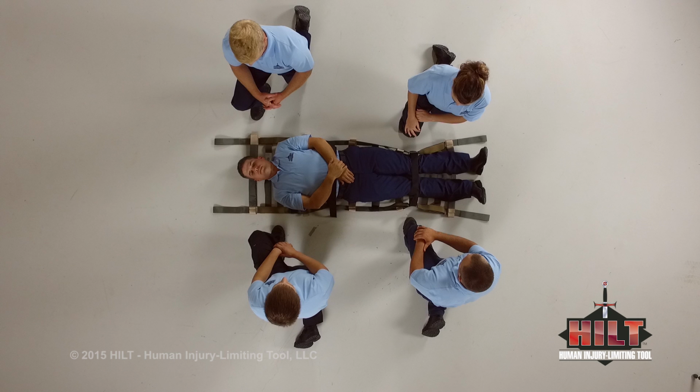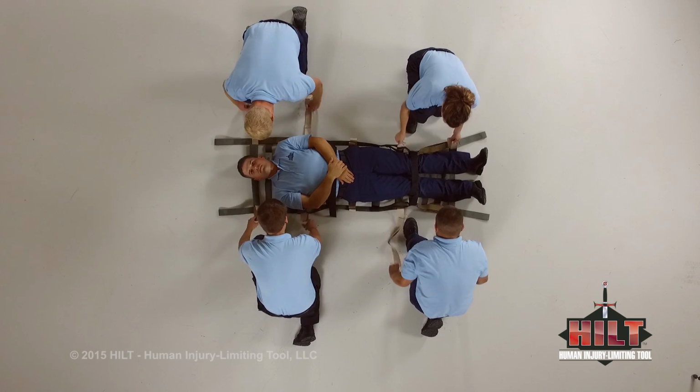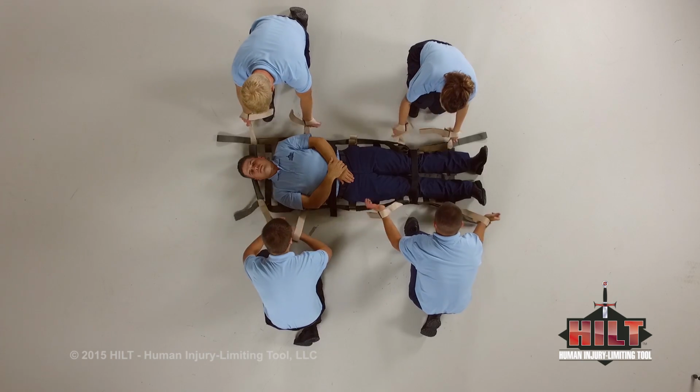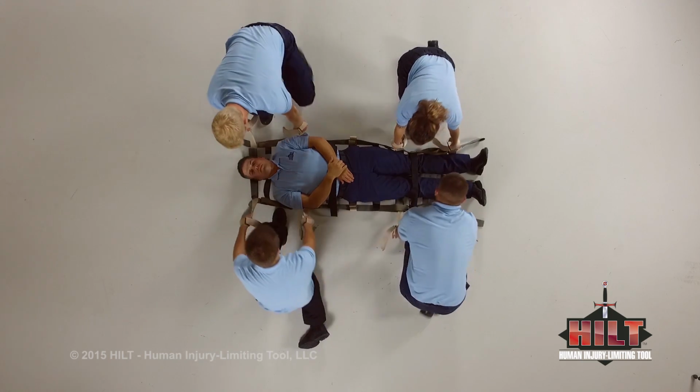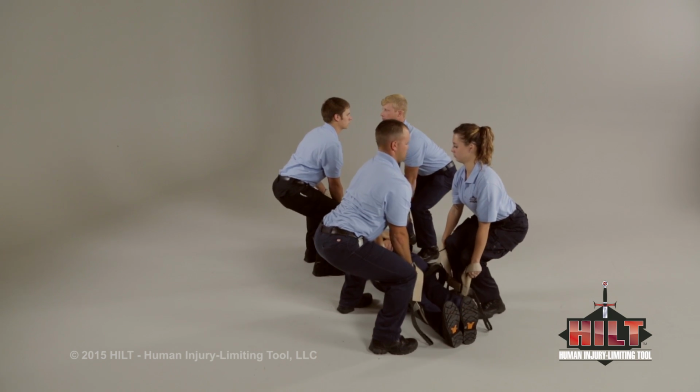To lift a patient with a full-length HILT with 2 attendants on each side, deploy the first and second sets of extenders at both ends of the HILT. Place hands into the desired extender handles for a low or high lift. Prepare to lift. On 3. 1, 2, 3.